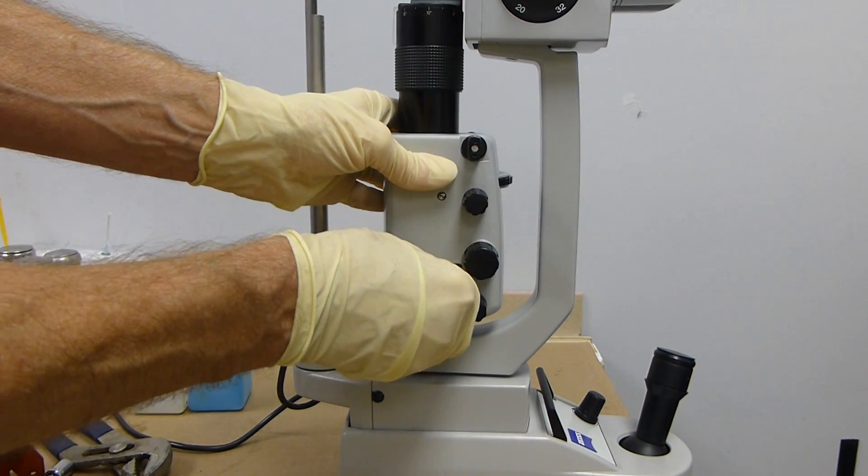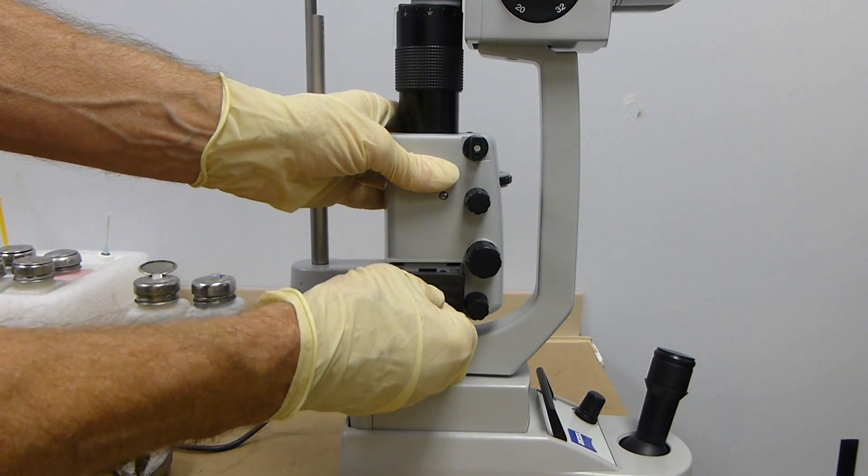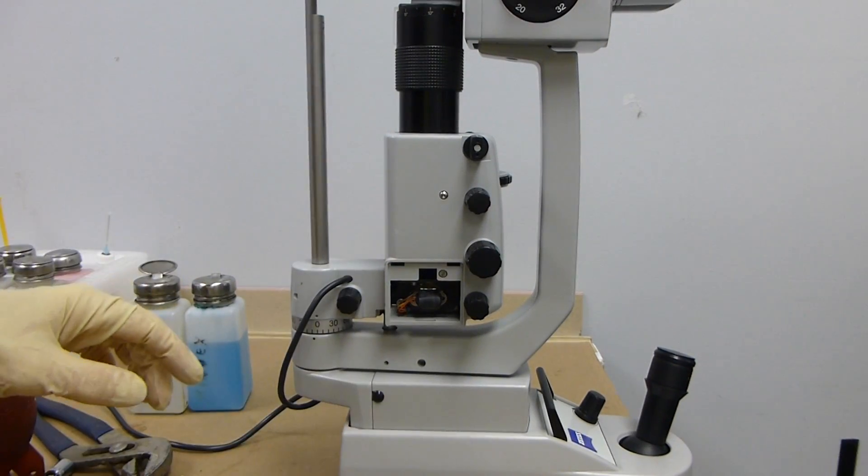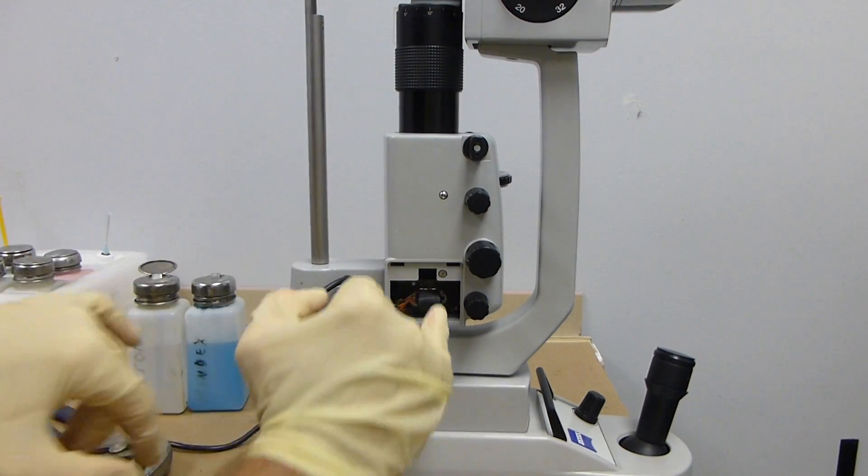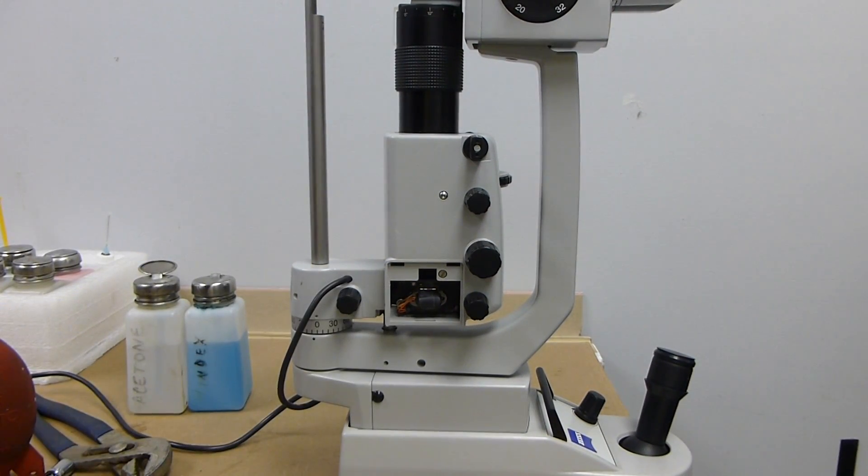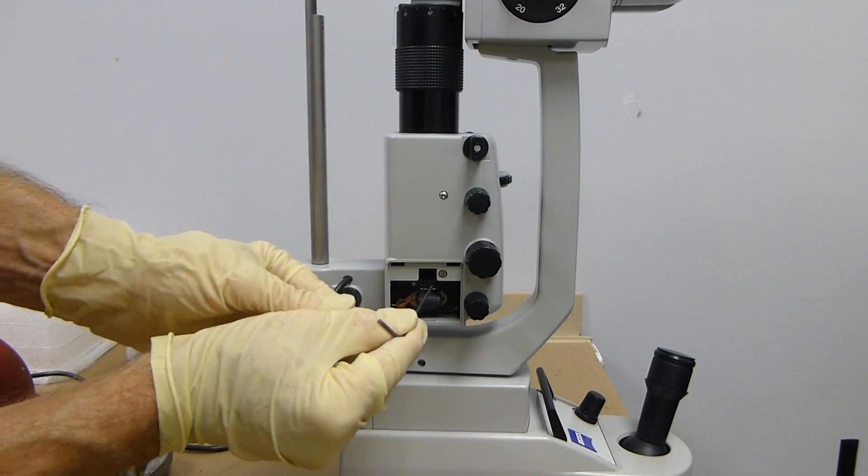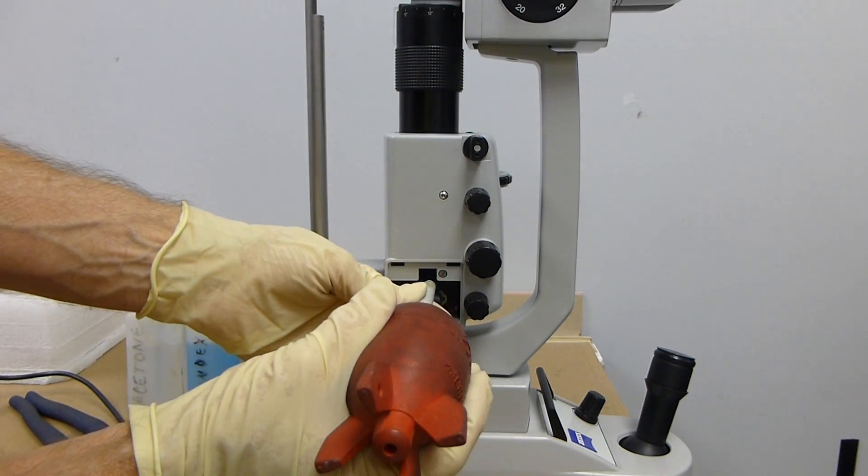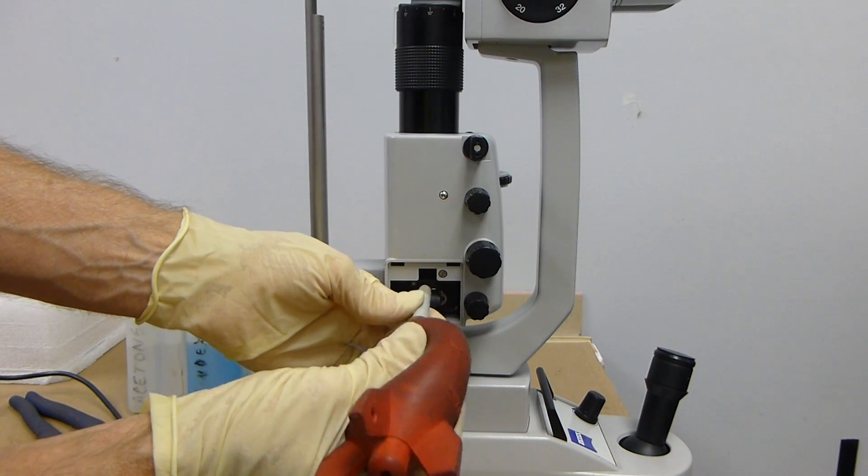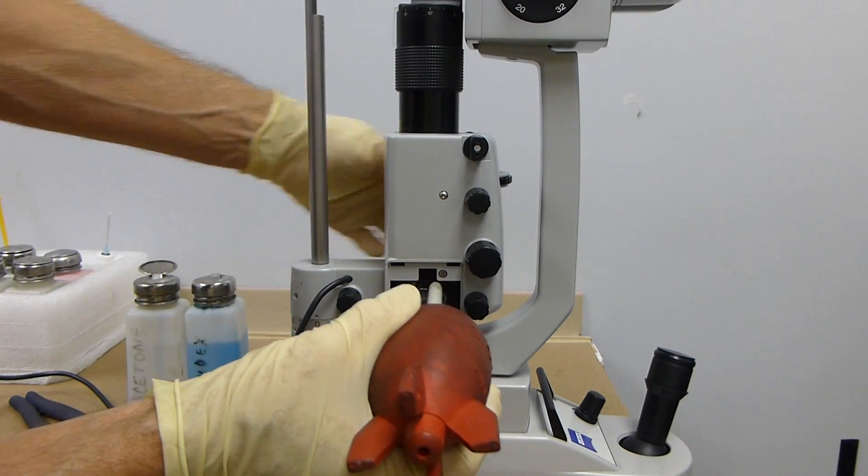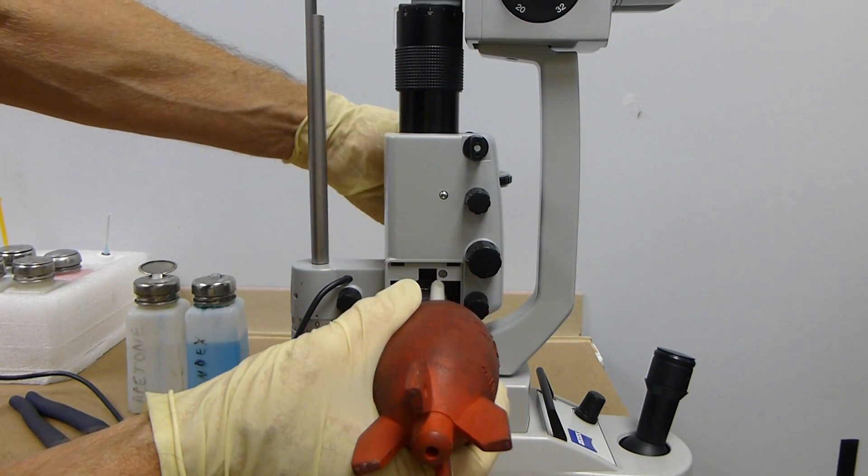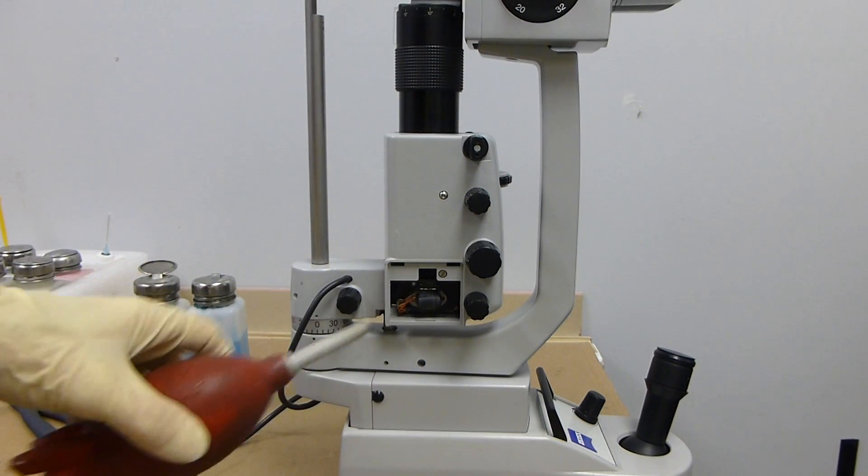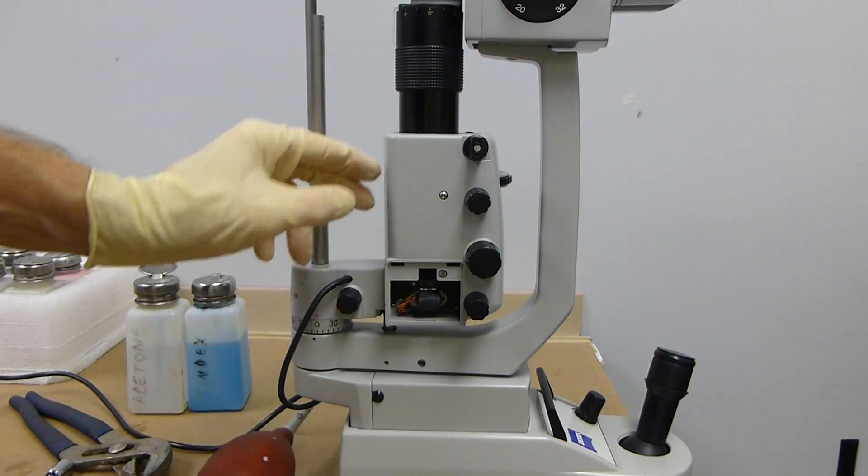You might be able to do it by taking off the bulb cover, pulling it down. There's a little bit of access through here where you can use your hurricane blower to blow inside where the slits are opening and closing, and you might be able to get dust off the slits.